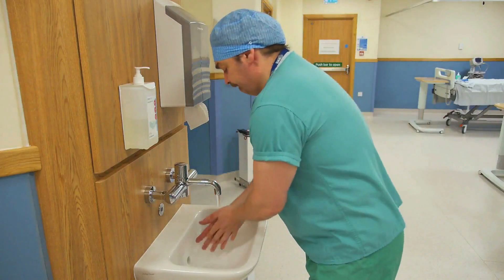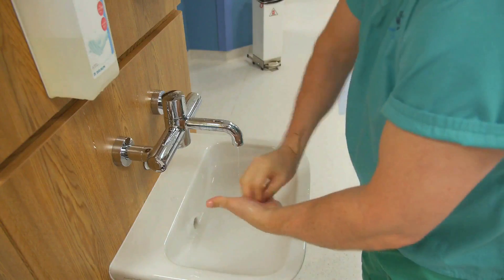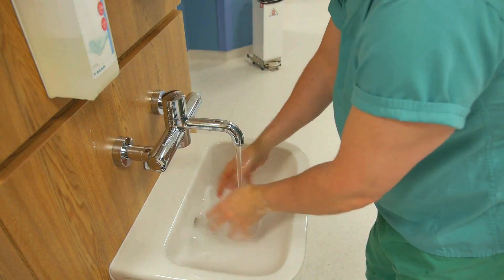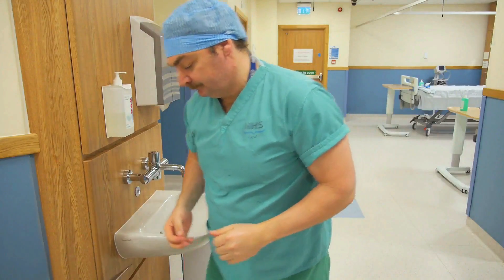On entering the patient zone, hands must be decontaminated before and after each episode of patient care. Liquid soap or antimicrobial disinfectant should be used. Disposable hand towels should be used to dry your hands and disposed of in a foot operated waste bin.